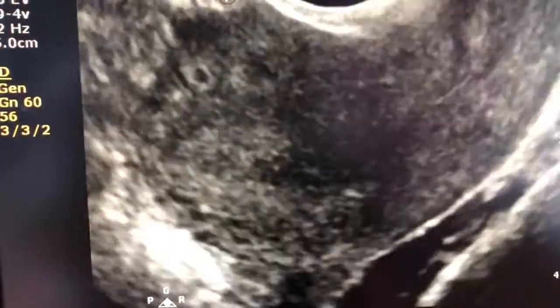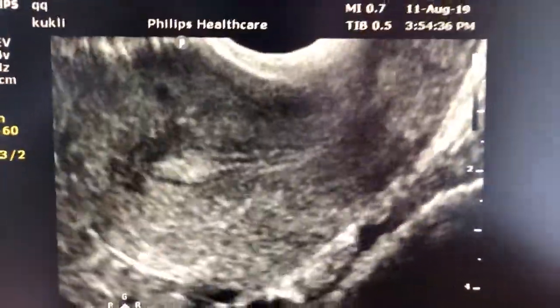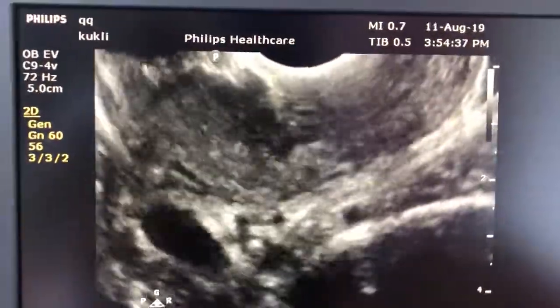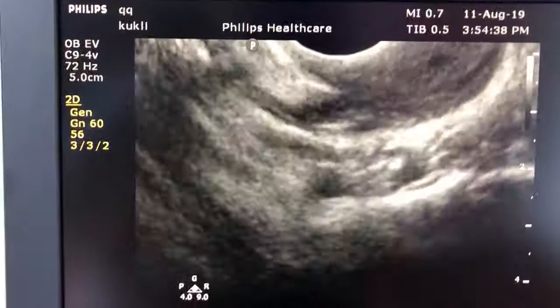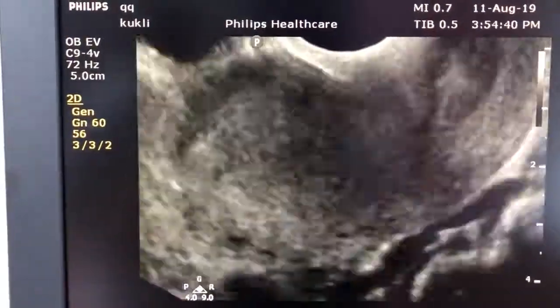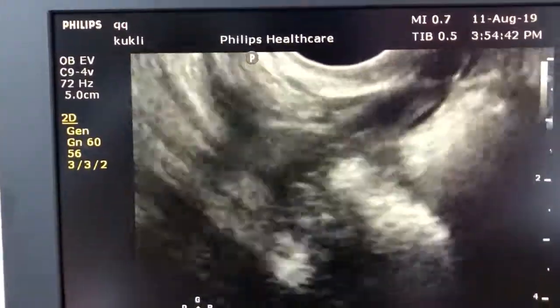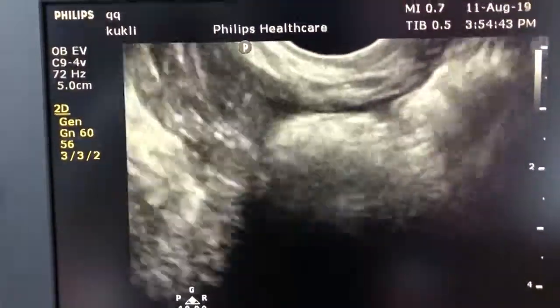Very beautiful polyp. Here is the polyp again in the transverse view.